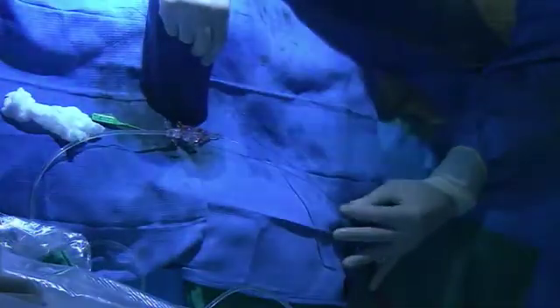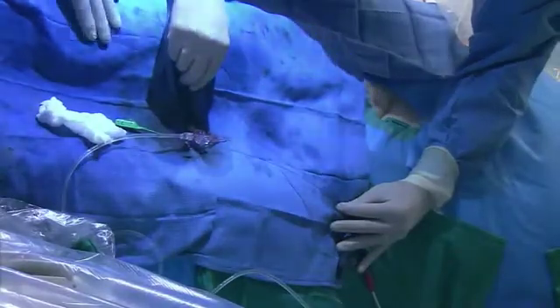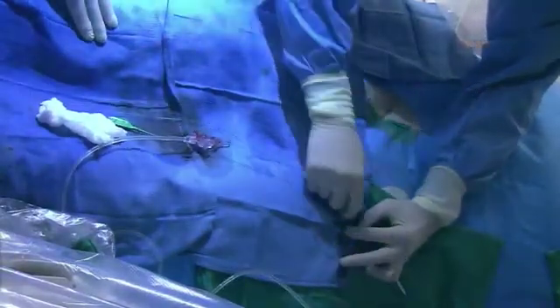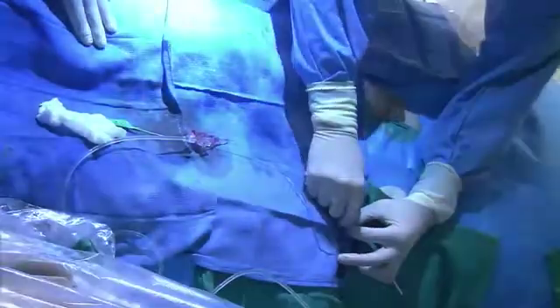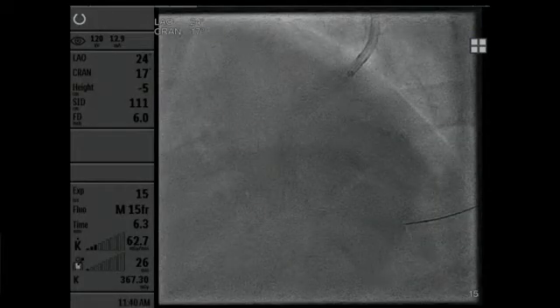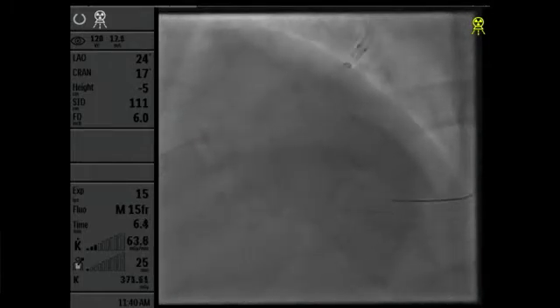But Rich, we see nodules in 18% ballpark of all the OCTs. Yeah, you do a combination for sure. But I think what you're going to see with the nodules, and I've been working on a lot of nodules with IVL now since it's been released, is you don't get it shaved off. You crack it, you fracture it, but it depends on the size of the vessel. You're not going to get the stent against the wall perfectly. It's much easier now.